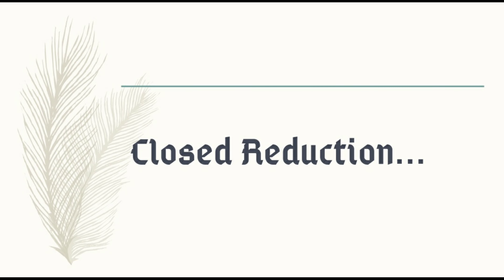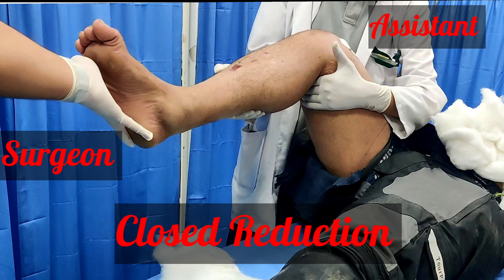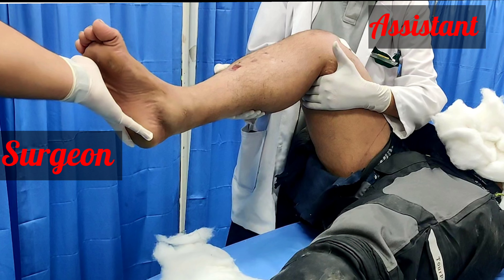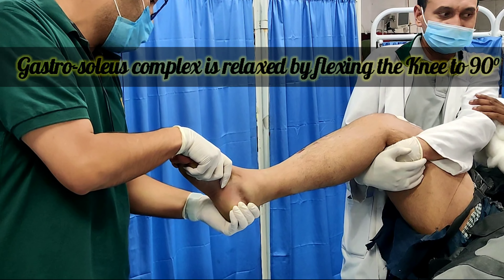I shall now demonstrate how to perform closed reduction for a lateral subtalar dislocation with a fractured talus neck. Two people are required to do the closed reduction. The surgeon stands at the foot end of the patient while the assistant holds the knee.